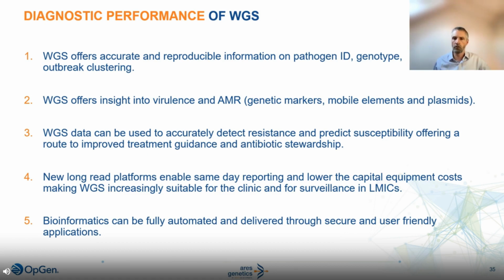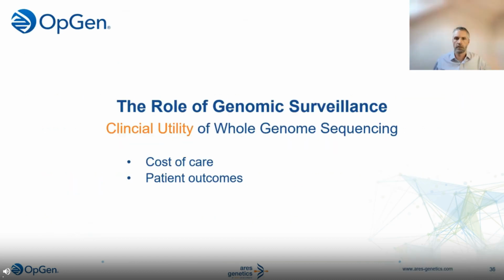The new long-read platforms are becoming a viable option for enabling same-day reporting and to lower capital equipment cost, which makes whole genome sequencing increasingly suitable for the clinic and for surveillance in low to mid-income countries. And finally, we have shown that bioinformatics can be fully automated and delivered through secure and user-friendly applications.